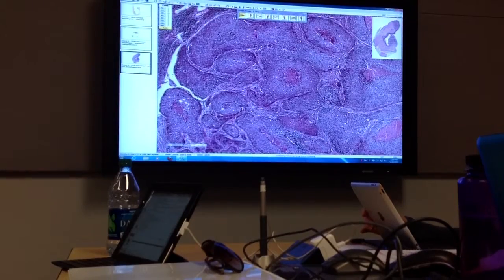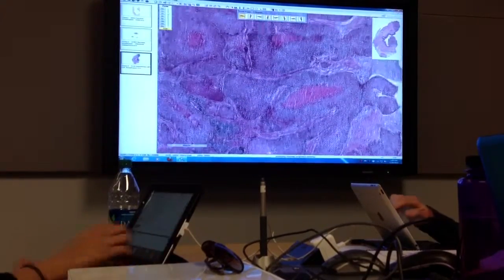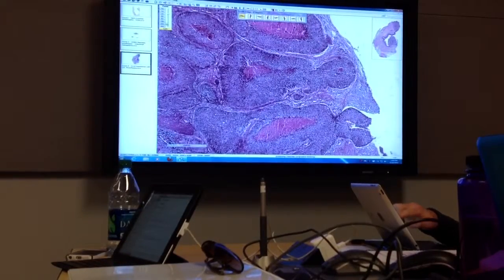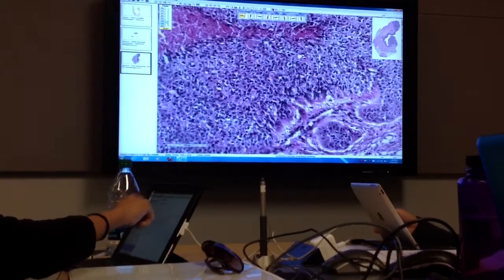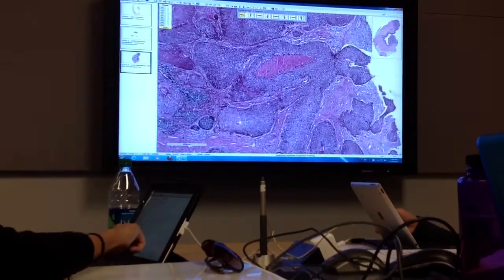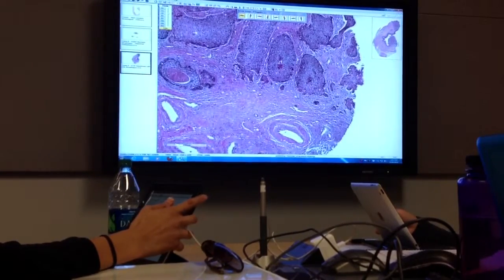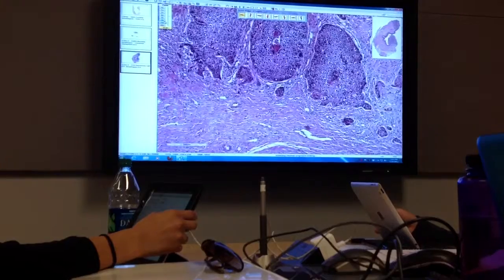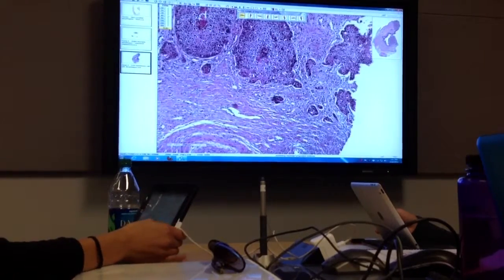Then it talks about lymphatic invasion. And let's see. Is this one? Lymphatic invasion can be tricky. No, I think that's just contraction artifact. So if you go, here might be some. Tumors get into lymphatics, and that's how they disseminate throughout the body.